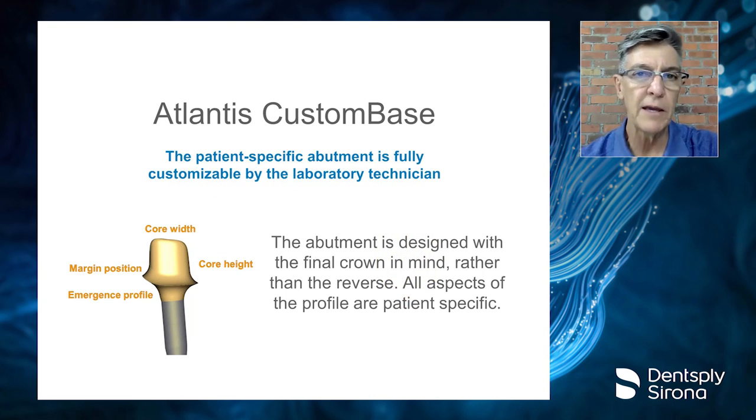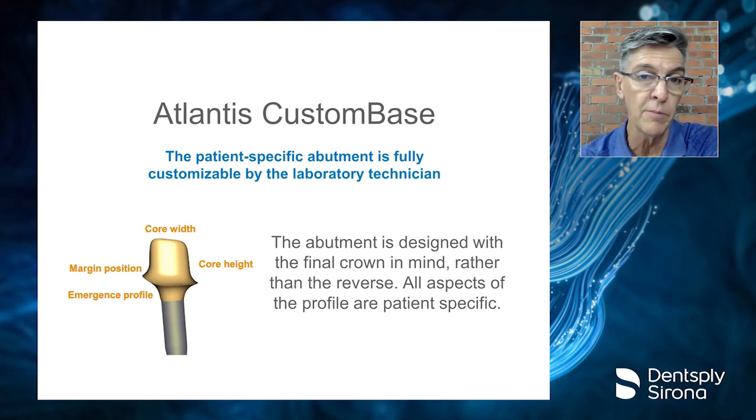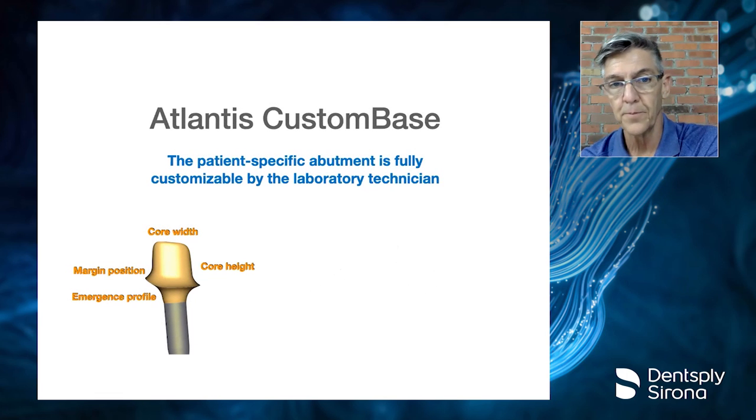So the custom base is just that, it's custom. It is an abutment that can be completely designed by your laboratory technician or yourself if you want to. So there's control over the general shape of the abutment, the margin position, the emergence through the tissue, how tall the abutment is, how wide it is, and so forth. So there's the ability to create what is really the ideal abutment for any restoration. It's a single tooth replacement.